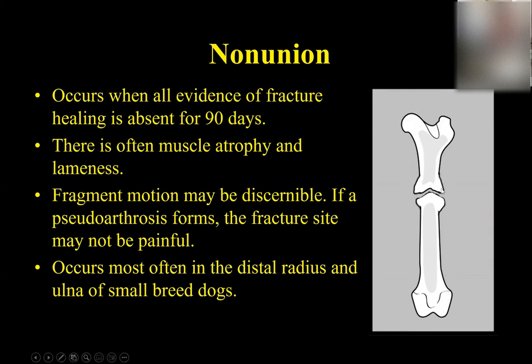So this is callus formation. At some point in time, the body was trying to heal it by second intention, but for whatever reason, it didn't work, and now the body's given up. Okay, a lot of times the fracture end plates will become smoothly marginated, well-defined. They're sclerotic. They're more white than normal, and that means that bone is not going to heal ever unless you do something.